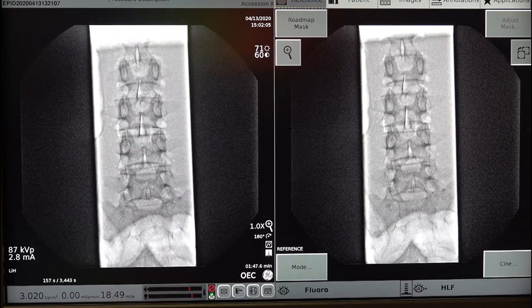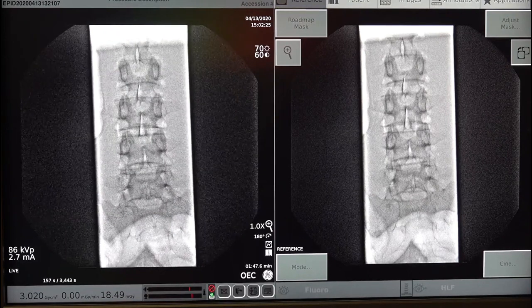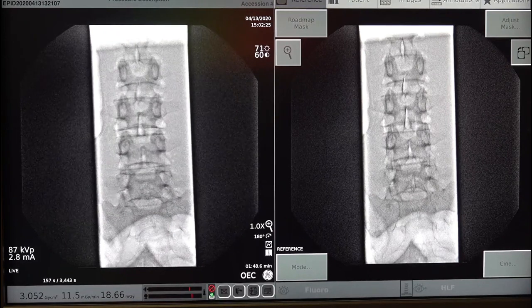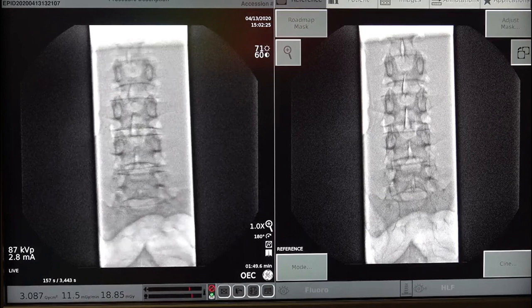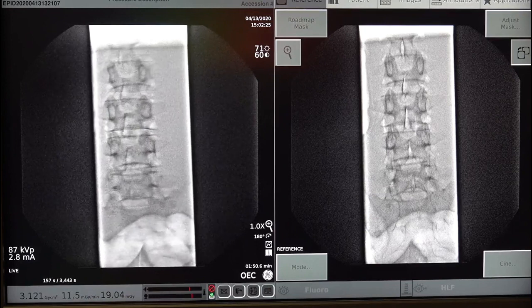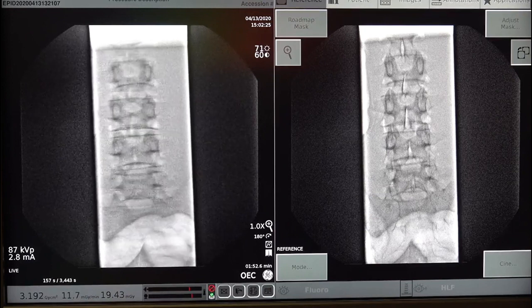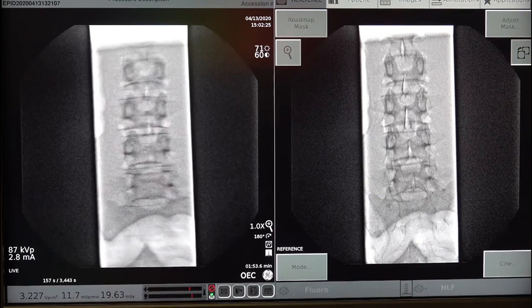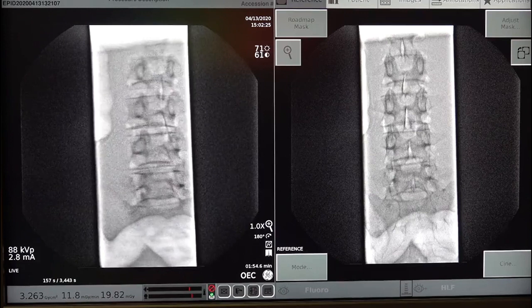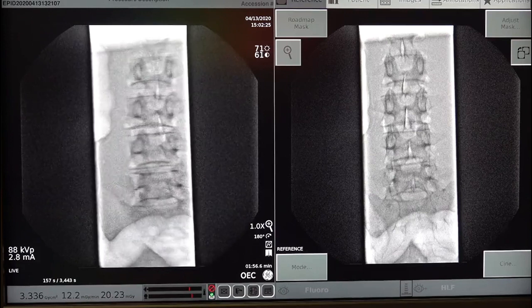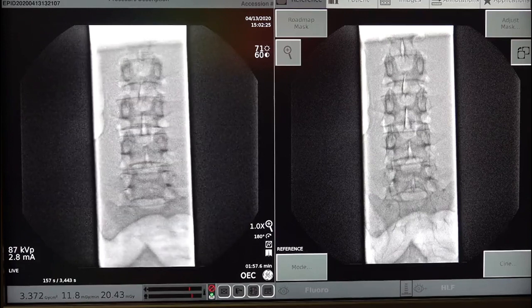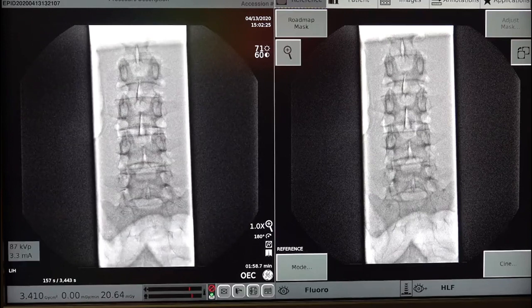Next, we're going to move over to our obliquity lock, which is going to help us get those spinous processes right in the center of the screen. As we go side to side, our angle is obliqued. The spinous processes right there are perfectly in the center.